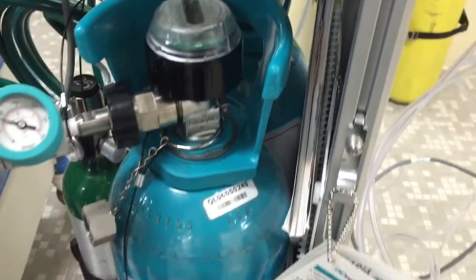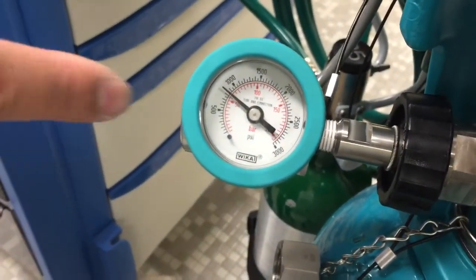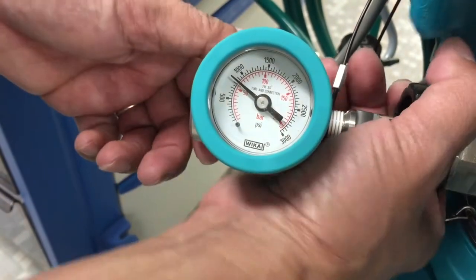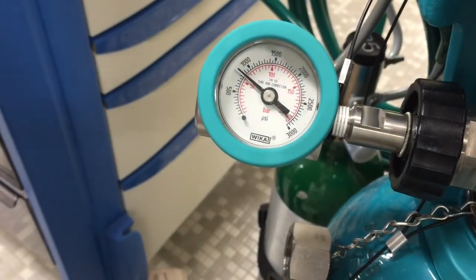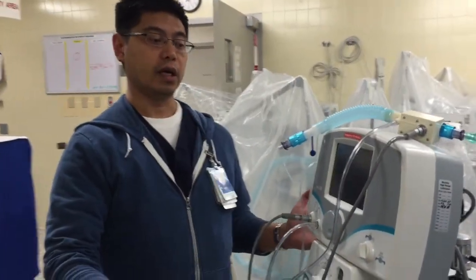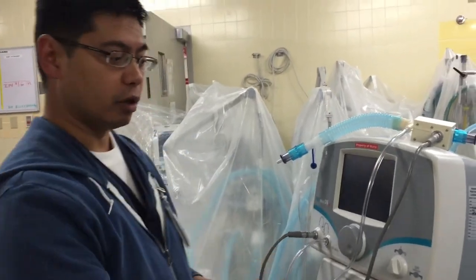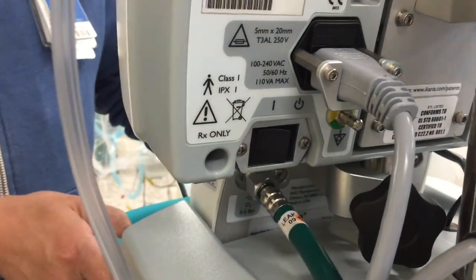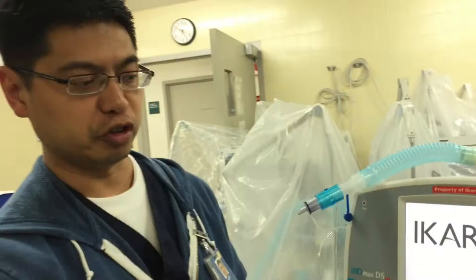When you turn it off, what you're looking for is whether the pressure will drop — that's part of your pre-use check. If it drops, you know that your seal is not tight enough and it's leaking, and you'll need to re-tighten the tank. Your whole machine is now set up. Turn it on — the on/off button is in the back, flip that on, and the machine will do its own pre-use check.